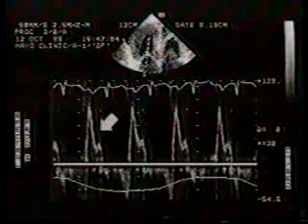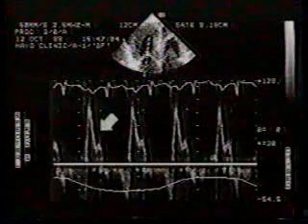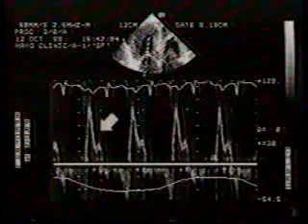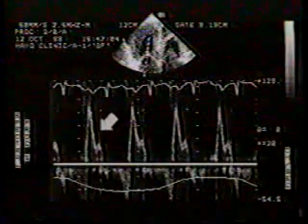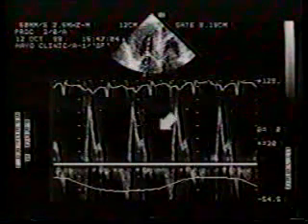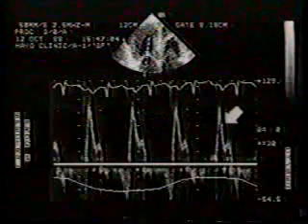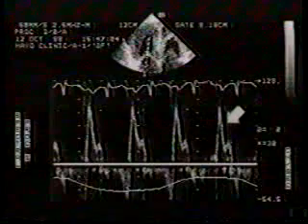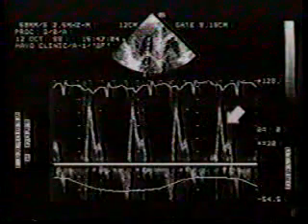Although careful measurements will show that in restrictive cardiomyopathy, the deceleration time shows further decrease with inspiration, you will notice that the mitral time velocity integral remains constant throughout the respiratory cycle. Hence, the respiratory Doppler pattern is distinctly different from that of constrictive pericarditis.